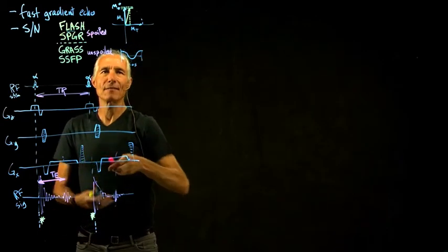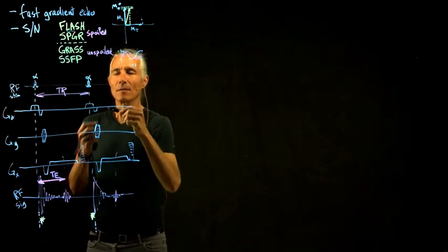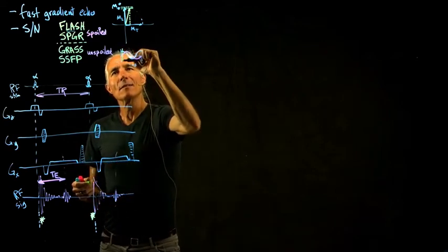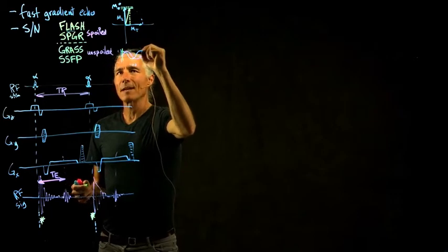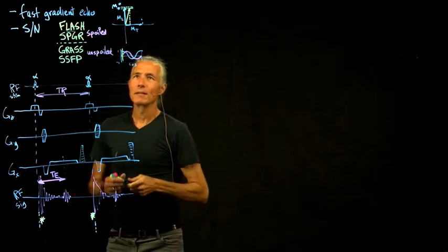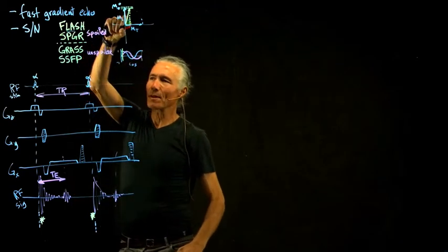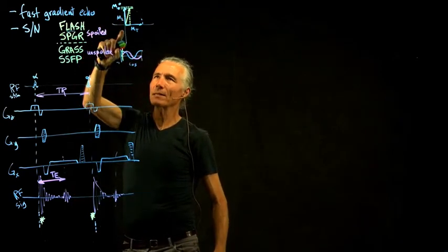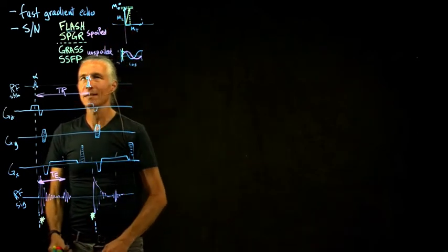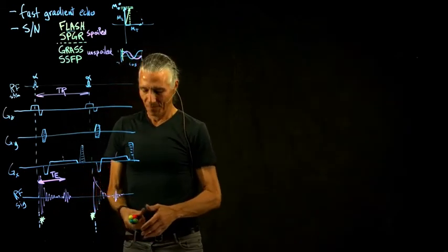Well, if we put the sine in that same graph, here's the sine. So if we stick right here, we won't lose much because of that cosine, but we'll gain quite a bit because of the sine. So that's the rationale. We won't have lost much longitudinal, but we still got quite a bit of transverse, so we can hammer away at a much higher rate, fast low angle shot. That's the principal idea behind the sequence.